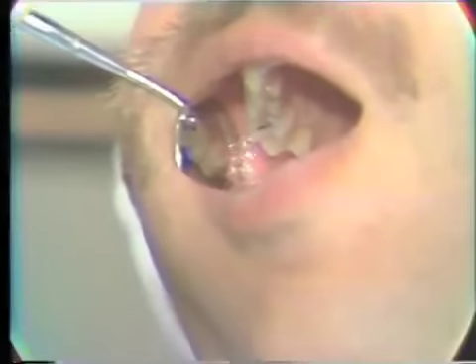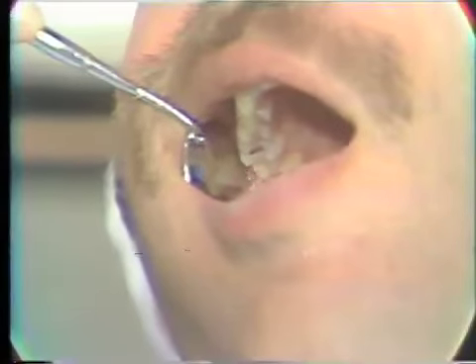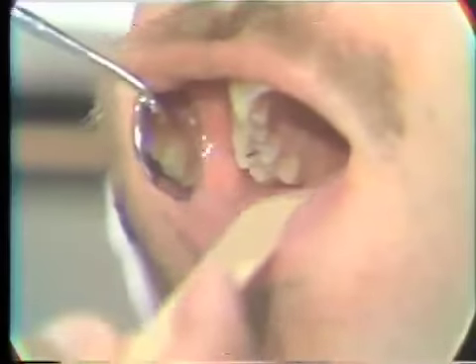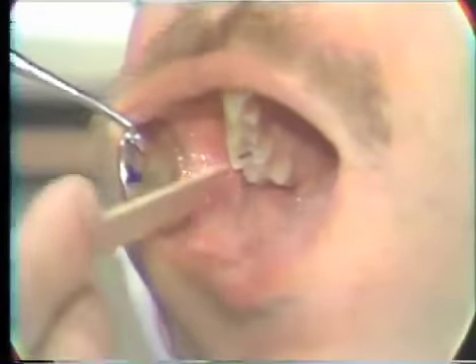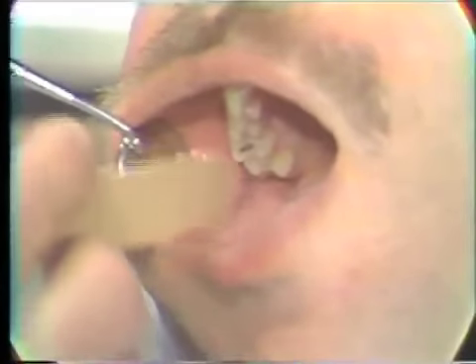It has somewhat of a red base and a hyperkeratotic area around the circumference. We will dry off the area somewhat and remove any excessive debris that may be there. We could, in fact, use this to smear one of the slides. We then pick up our tongue blade and again go to the lesion and scrape vigorously so that we get material from the base of the lesion.